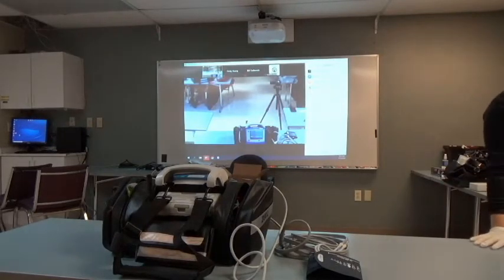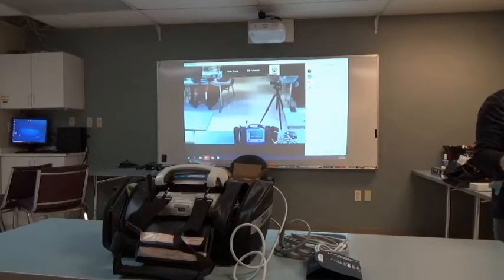So we're on analyze AED mode. We're hitting the home button and it's doing nothing. Correct. Home will not get you out of AED mode. Can you remind me then what it was? Yes. So exit. Exit.